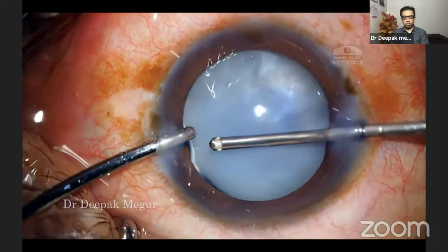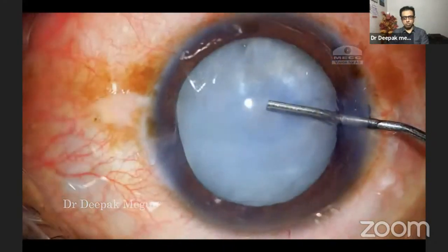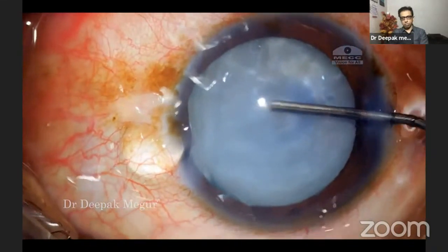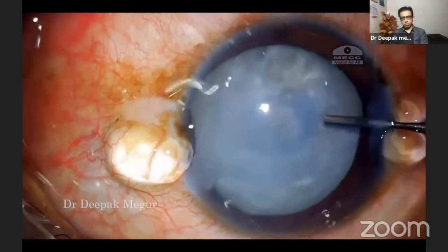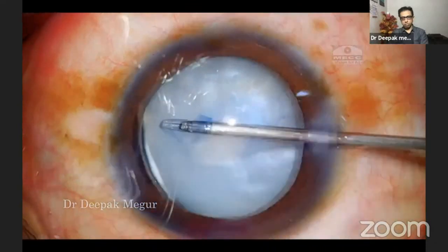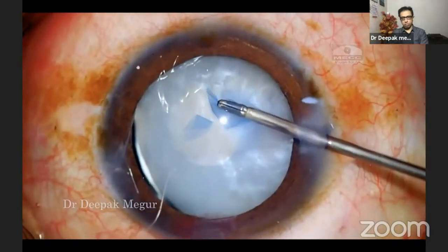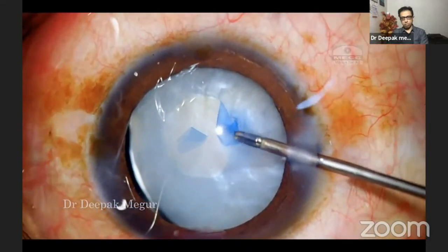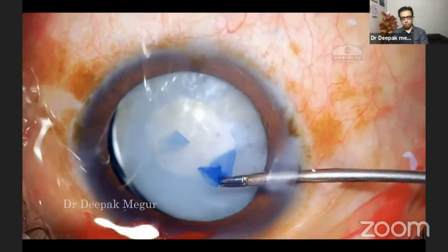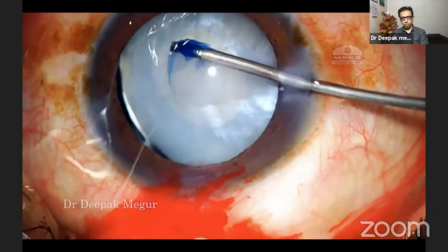I'm plugging the area of zonular dehiscence using a dispersive OVD. Under this, I'm using a cohesive OVD to push back the anterior capsule so that I can get a capsulorhexis done easily. During the rhexis, I realize that the rest of the zonules are quite healthy. The capsule rhexis could be done quite easily. I'm aiming to do a rhexis of about 4.5 to 5 mm. The smaller rhexis is going to help me achieve optic capture if the need arises.